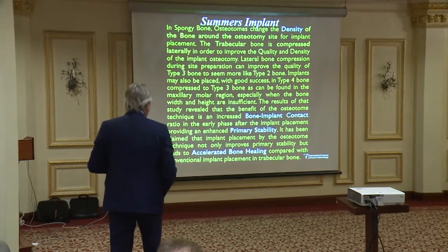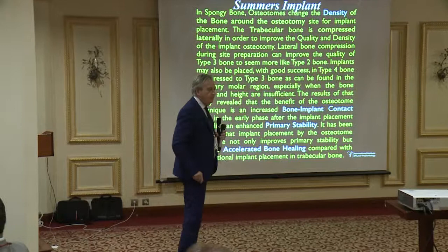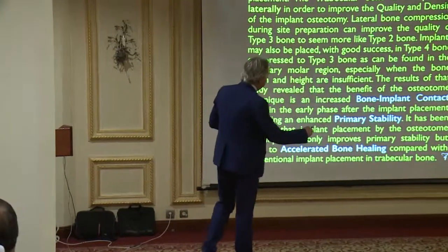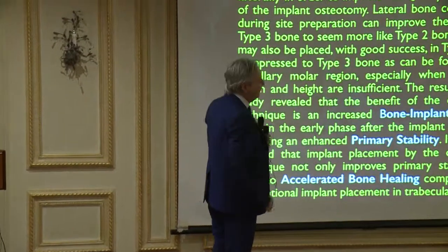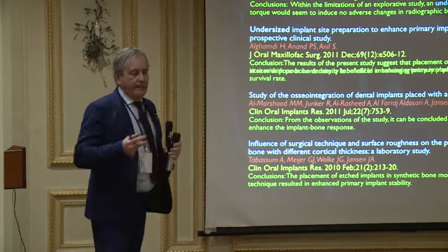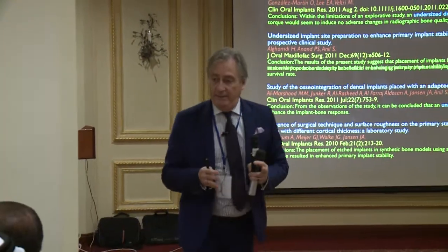And very often what happens is that you're accelerating the bone healing. Anyway, they all end up with a rise of the primary stability, gaining in bone density, and in bone-implant contact. What about this and the sizing? Because everything is linked.